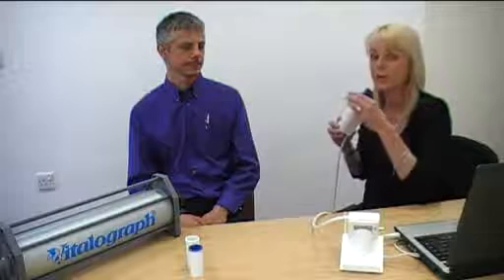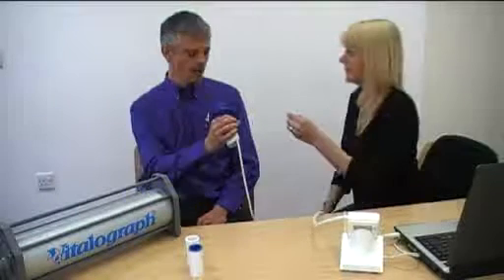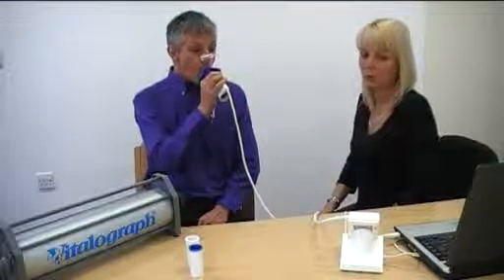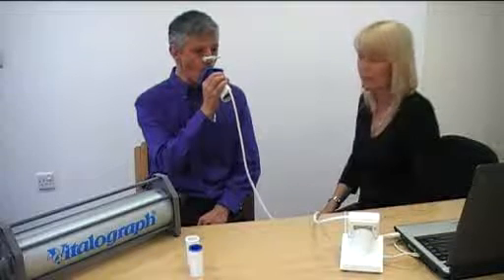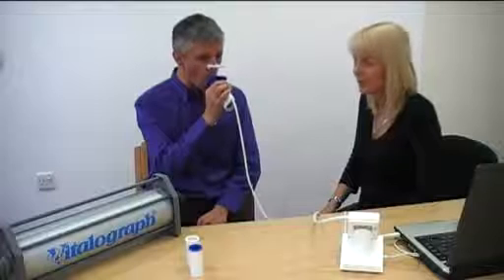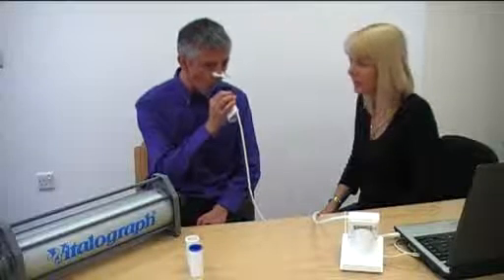You need to explain to the patient exactly what you want to do and you need to encourage the patient. Nice deep breath and blow. Blow, blow, blow, blow, blow. All the air out. Blow. Thank you.